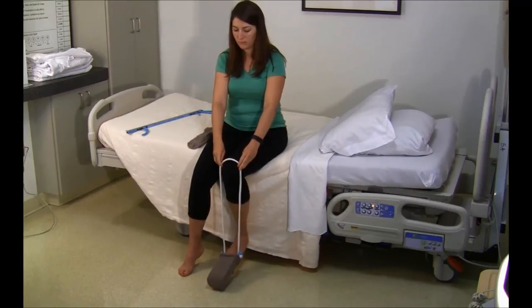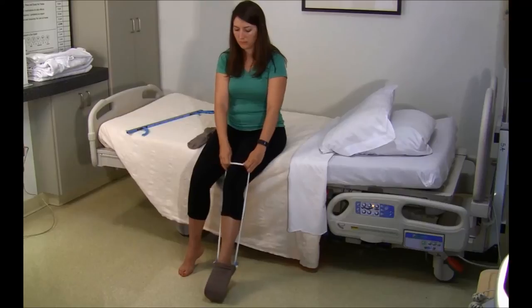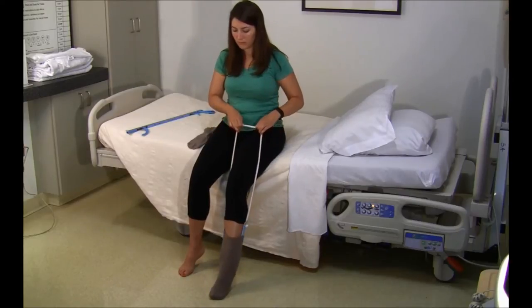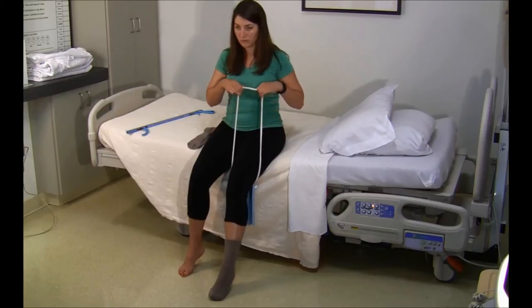Place your toes in the opening and walk your foot in as far as you can. Once your foot is in the stocking aid, pull the string towards your body. The sock should pull up fully on your foot.